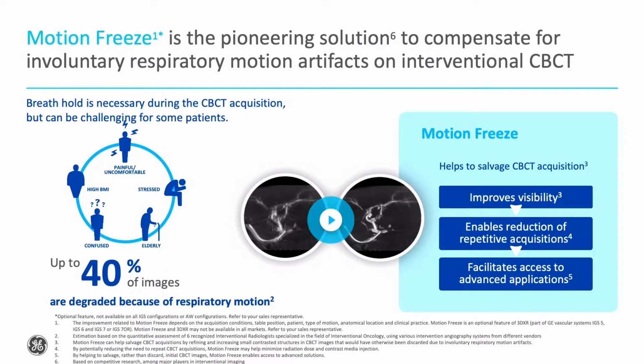patients may be too weak, too old, they may not be able to hold breath, or they may not understand what you say because they don't speak the same language as you. So you can practice with them before the treatment, but still you will have a subset of CBCT images you will not be able to use. So now you can do a new CBCT 1, 2, 3 times, but there is a problem of injection, there is a problem of dose deposition, of time, or you can just not use that, but it's a shame because I just told you before that you really need this to be better.